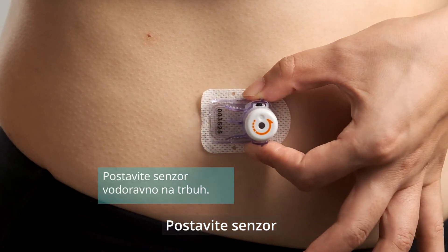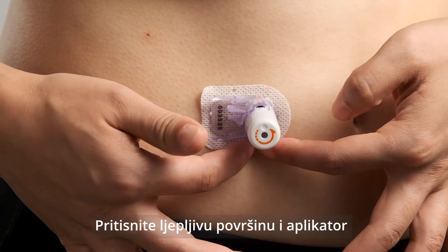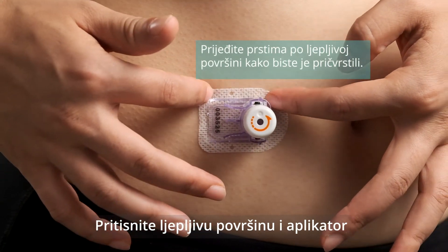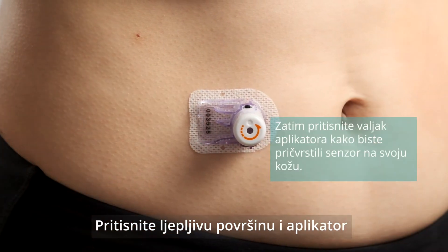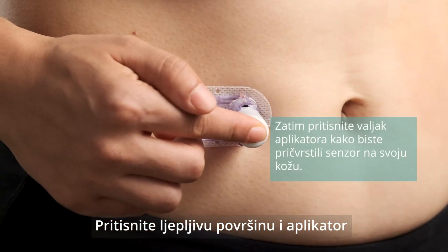Place the sensor horizontally on your abdomen. Move your fingers around the adhesive patch. Then press the insert cylinder to secure the sensor to your skin.